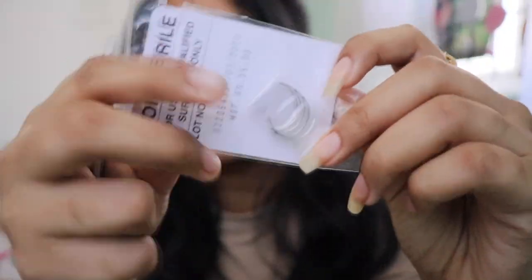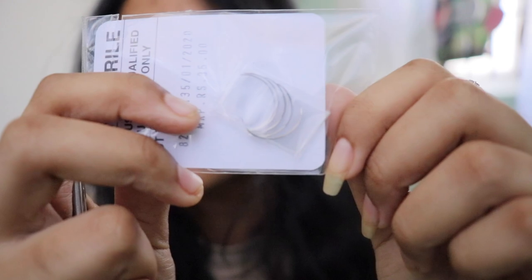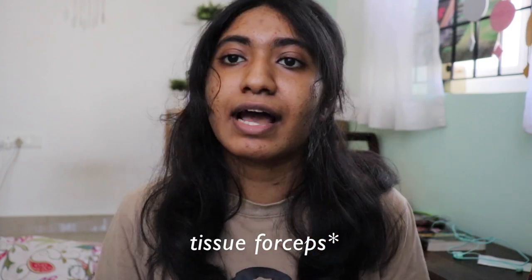The needle is over here, if you can see. Yeah, that's the needle. It's one curved needle. And I have forceps over here. Actually, I didn't buy these forceps for this. I got it for that goat mandible extraction. So that's the forceps. So these are the instruments that I have been using to do these sutures.